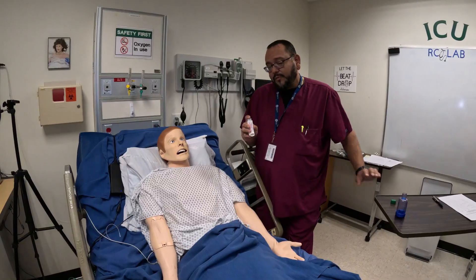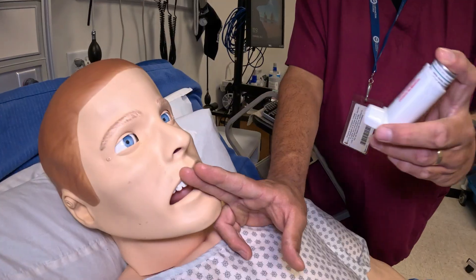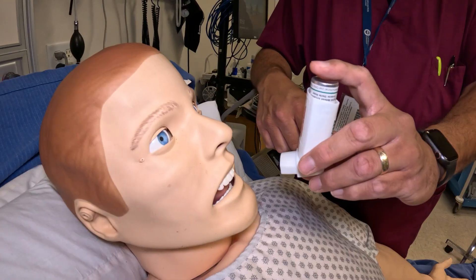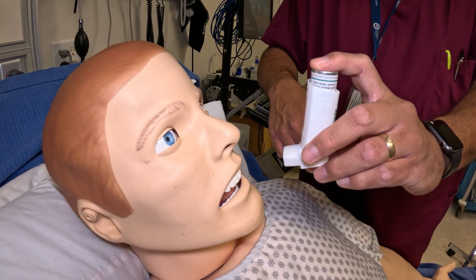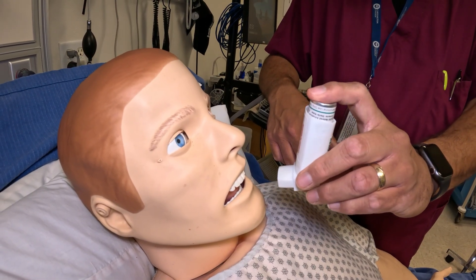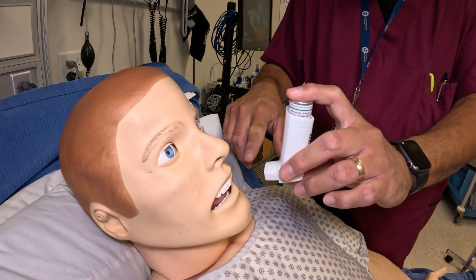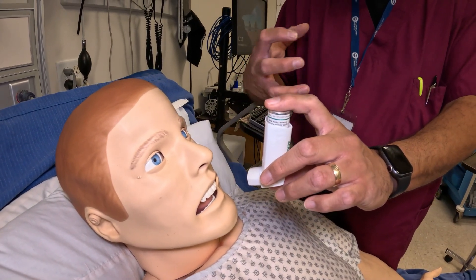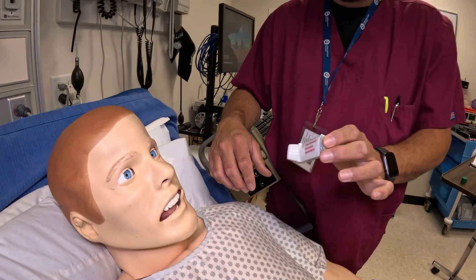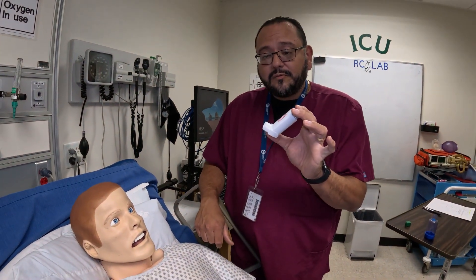If you were to do it without the spacer, it's almost similar except you're going to use a two-finger technique and have the inhaler in front of the mouth. When the patient goes to breathe in, they give their puff, breathe in and hold, and then breathe out. Then they do it again: push down, breathe in and hold, then out. This way, less medication gets on the back of the throat or in the mouth, but it does take a lot more coordination. The better treatment is with the spacer versus without it.